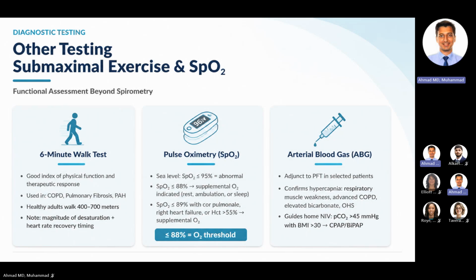For example, if a patient is hypoxic at rest, with ambulation it drops further. So he might require 2 liters at rest. He might probably require even more oxygen when he is ambulating. And for those individuals, it's important to do an overnight pulse oximetry study, either on or without oxygen, to determine if that individual drops on the oxygen that you're providing so that you can give him the right prescription to use oxygen when he sleeps at night.